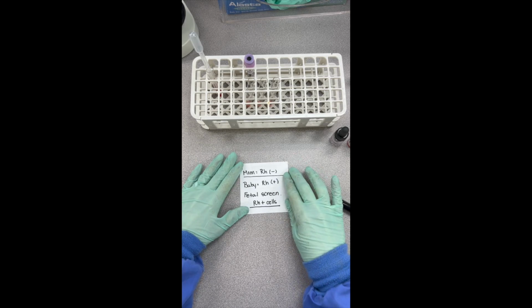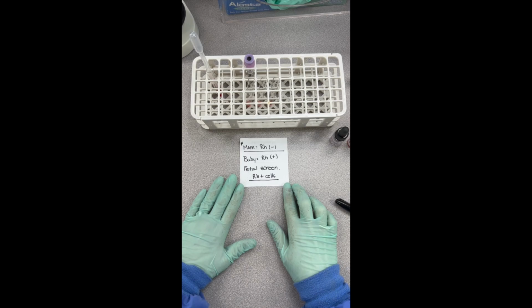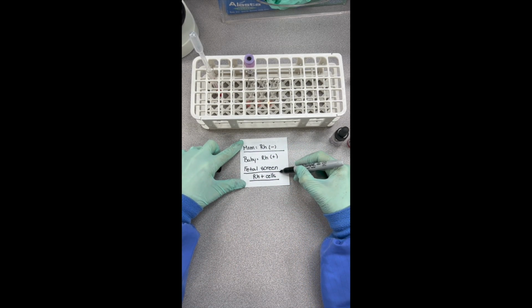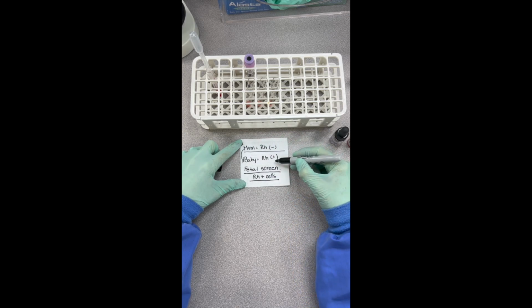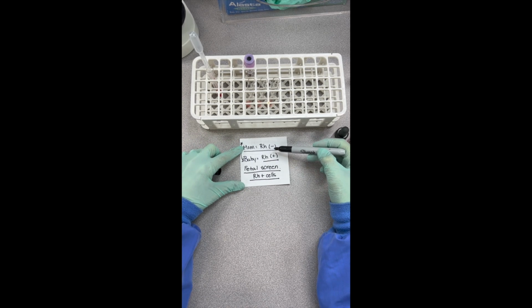Okay, so now let's talk about what's going on in that tube and why we're doing this. So you can see this here. I have some little notes that we're going to talk about. Now, a fetal screen, so here's our fetal screen that we're performing, is only done on an Rh negative mom. It can only be performed on an Rh negative mom. And we're only going to do it on a mom that actually has an Rh positive baby. We have no reason to do this on a Rh negative mom that has an Rh negative baby because she doesn't need RhoGAM.